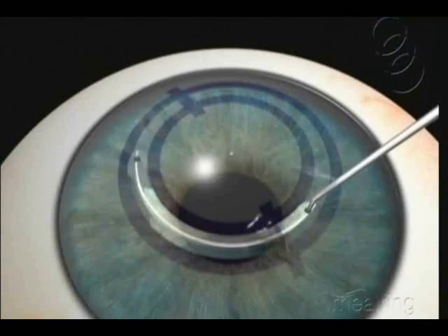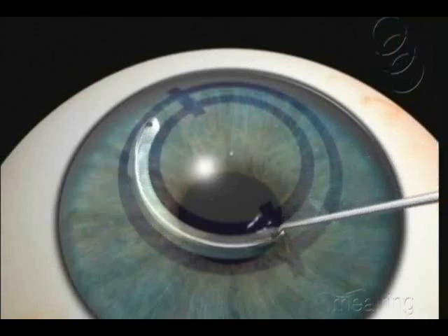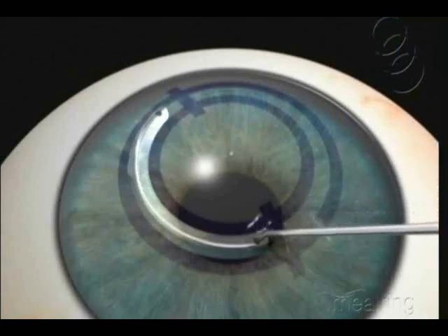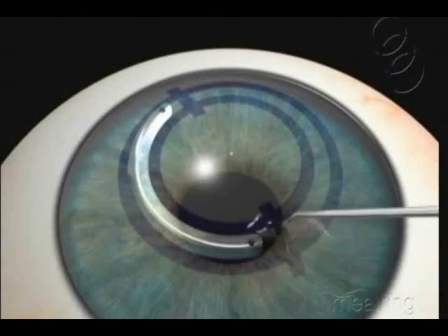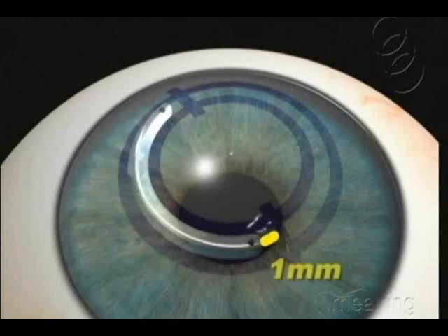Insert the Sinski tip inside the ring hole and push it into the tunnel. The ring ends have to be positioned at the same distance from the steepest meridian and at least 1mm away from the incision.